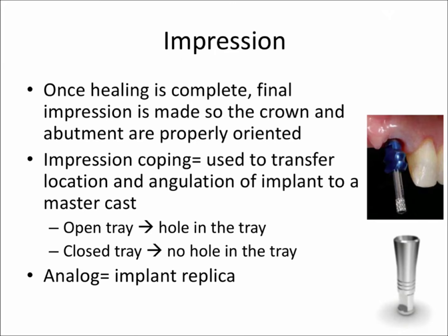So this slide is totally beyond the scope of the board exam, but I just wanted to include this information, number one, because I'm so excited about it, but number two, because I know a lot of you are really curious about implants. So the open tray impression is when you physically drill a hole in the plastic impression tray so that, once the impression is seated, you can access the coping once the material sets. So there's a hole in the impression tray.